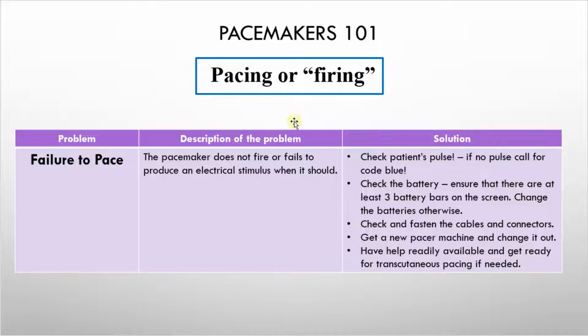We should check the battery, make sure that there is enough battery and the batteries are installed properly, otherwise change the battery. Check the cables and the connectors, make sure they are fastened and connected securely and properly. If after all of that the pacemaker is still not working, change the pacemaker machine to a new one because the machine could be defective, and always have help readily available should the patient's condition change.